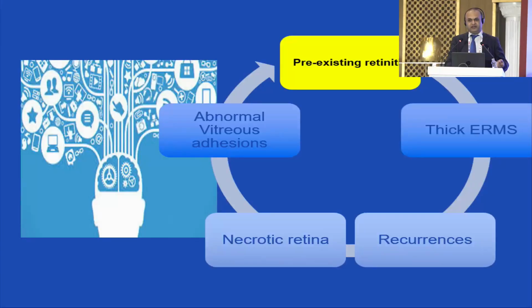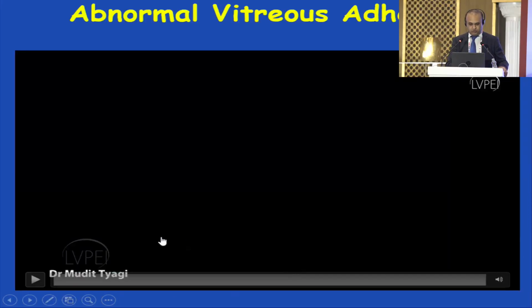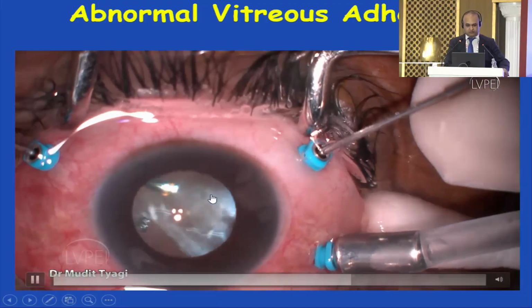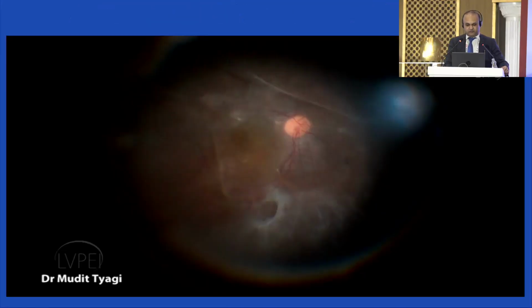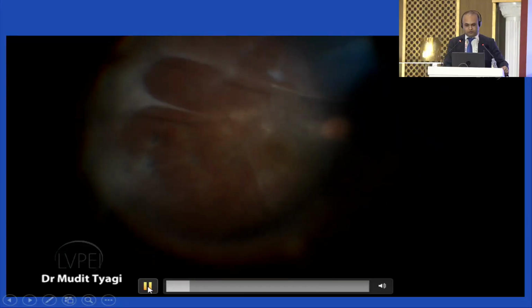Look carefully for breaks, look for areas of necrosis. If there is extensive active retinitis, you also need to take care of that apart from the detachment. The vitreous is slightly different, thicker, and more densely adherent in these eyes. Let me show you what we are talking about. This is how you see this thick sheet of vitreous. This is how the vitreous in eyes with ARN and CMV behaves: extremely thick sheets, some very densely adherent, so you may have to take time to truncate.